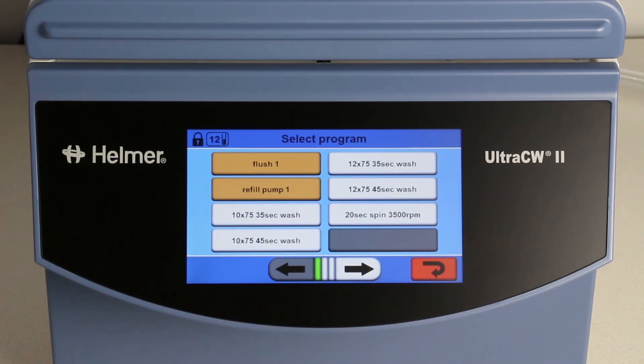For our users' convenience, a selection of pre-installed programs comes on the Ultra CW2, including flush, refill pump, four wash programs, and a spin program.